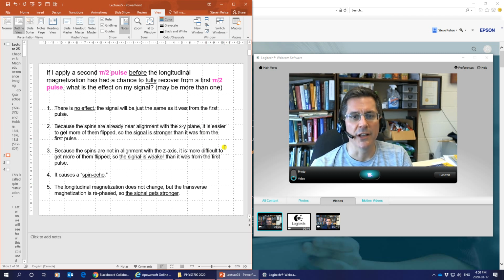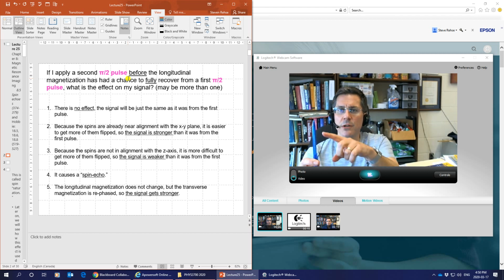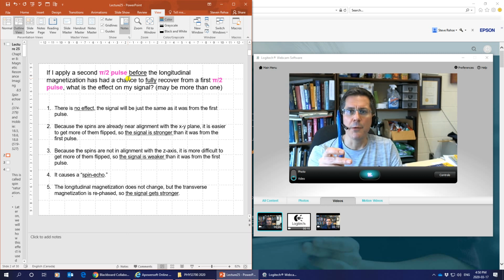All right, so let's start with this then. So the first question for today's lecture, this is lecture 25, is going to be this. So we talked about last time applying the pi by 2 pulse. What is the pi by 2 pulse? Well, if you have a magnetization that's a net magnetization of your protons, that's straight up, the pi by 2 pulse is the spin flip. So the spin flip is going to tip all of those spins into the xy plane. If this is z, then that's xy, okay? And that's the pi by 2 pulse, because pi by 2 is 90 degrees. The magnetization has done that.